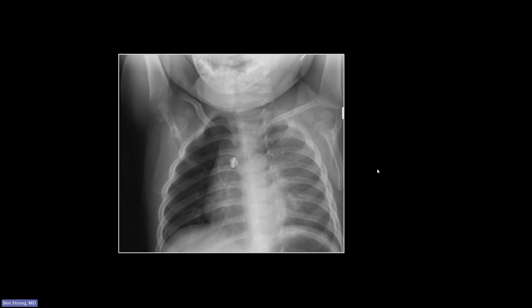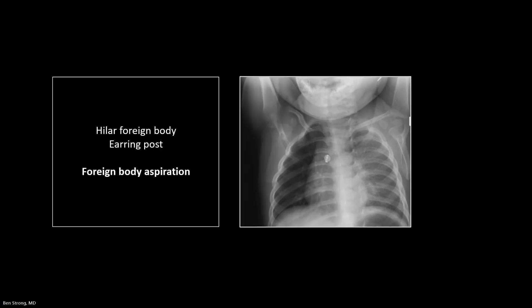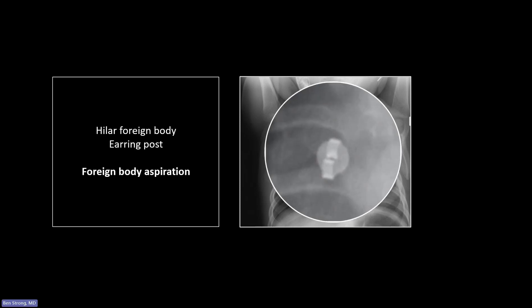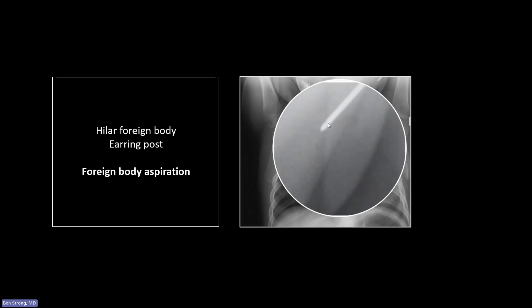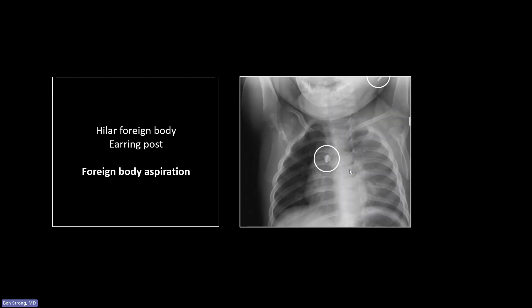This is an aspirated foreign body — this is an earring backing. You can see the difference in the posterior rib interspaces and the difference in lucency of the lungs, with a hyperlucent, hyper-expanded right lung. But there is that backing, and you can see the naked earring post still in the patient's ear.